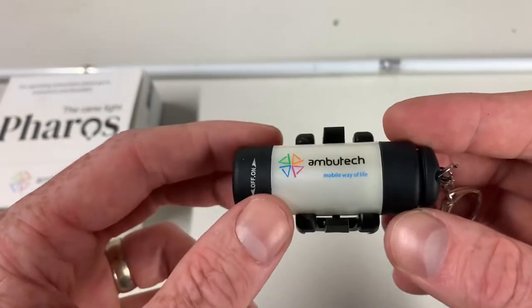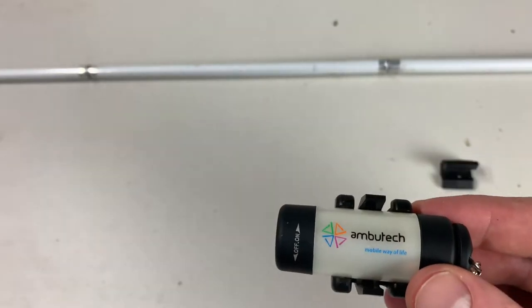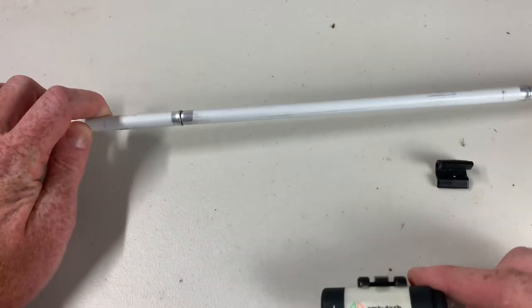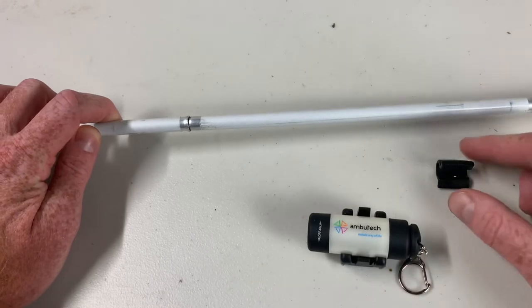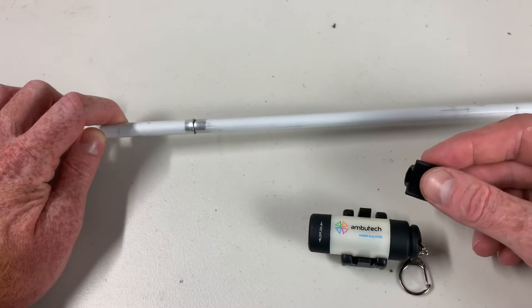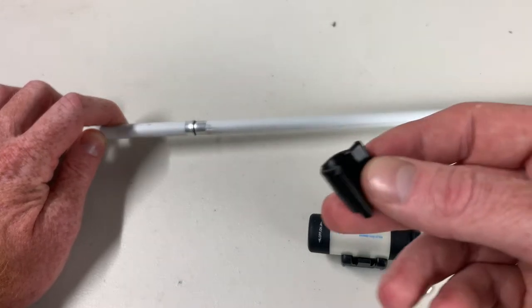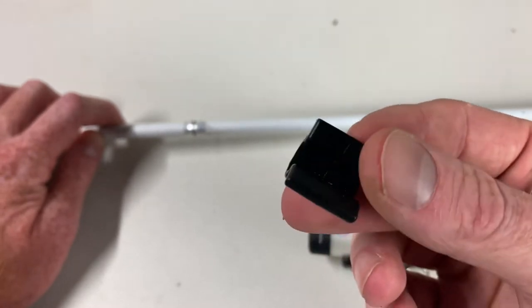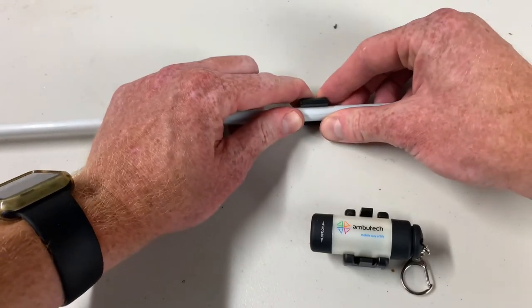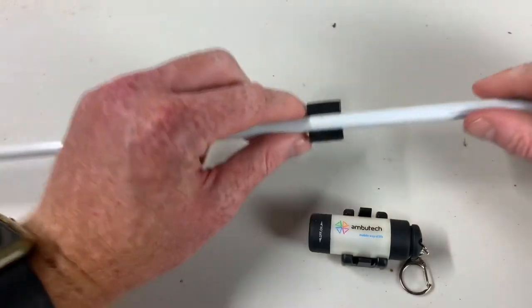Now I want to show you how it attaches to a cane. I have an ID cane here in front of me. One nice thing is it comes with different attachments — if you have a regular long white mobility cane, there's an attachment for that. It comes in three different sizes. This one is designed for an ID cane, so I'm going to clip this on now. I'm clipping that little black plastic clip onto the cane and it's snapped in there.